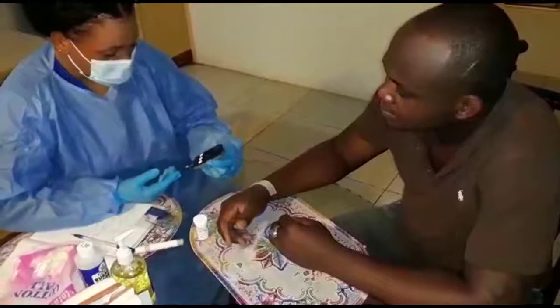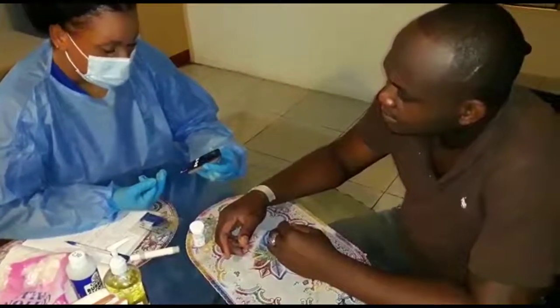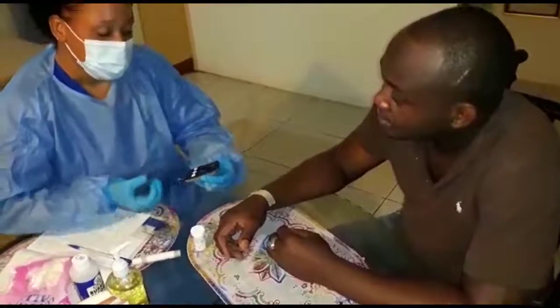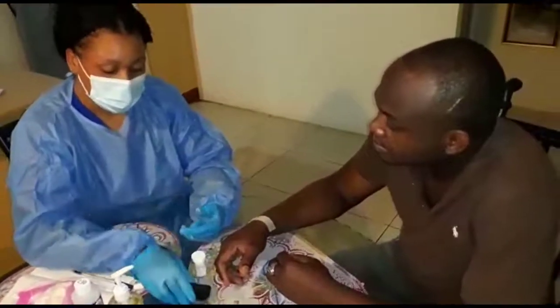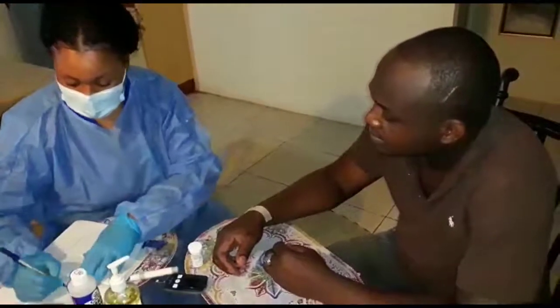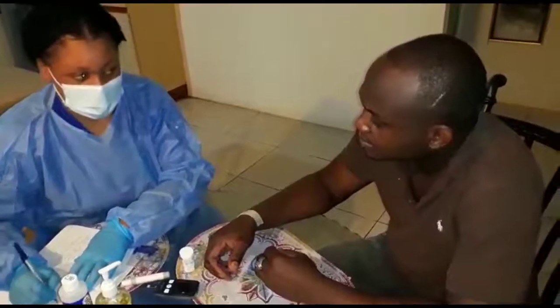Okay, just waiting for the result, Mr. Williams. And your blood sugar level states that it's 8.0. This means that you are diabetic. So I'm going to be documenting this finding, and you'll be referred to the necessary health professionals as needed.